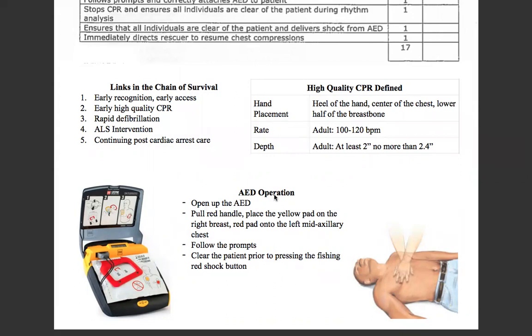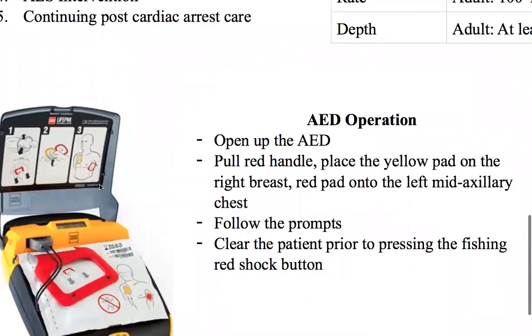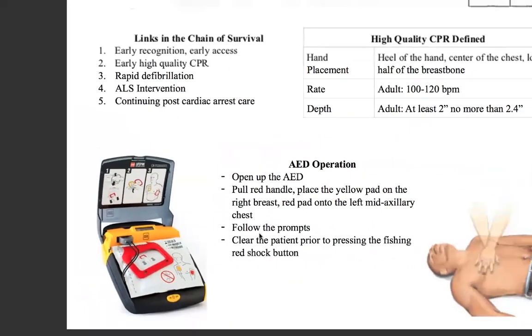These are the training AEDs we use. Basically, all you have to do is open up the AED, pull the red handle, and place the yellow pad on the right breast — as you can see in the pictures right here. Place the red pad onto the left mid-axillary chest, as you can see here. Just follow it exactly as you see in the picture. Once the pads are applied, the machine will instruct you to clear the patient, then analyze the rhythm — you don't have to press a button to analyze. It'll give you a shock advised or no shock advised. It'll charge up, show a flashing red button, and you'll make sure everybody's clear again before pressing the shock button.